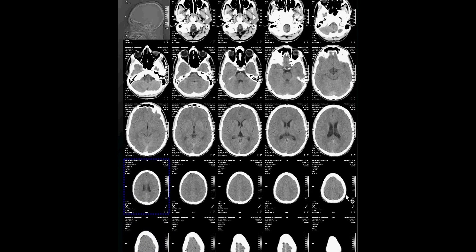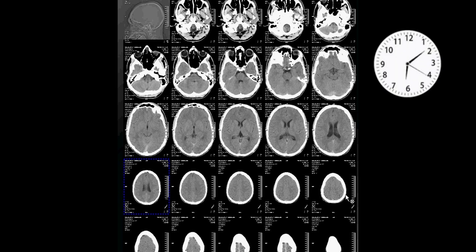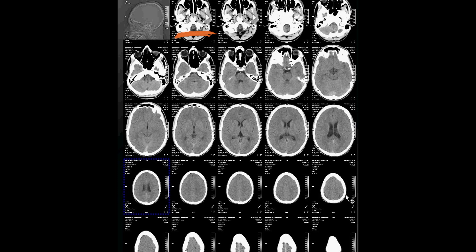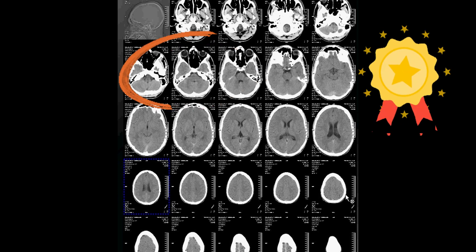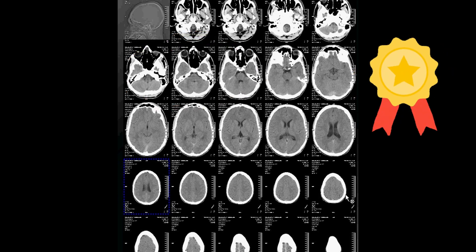On this film, in which slice do you see the posterior fossa? If you answered any of these slices, you can consider yourself right.